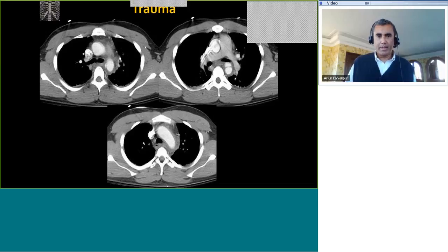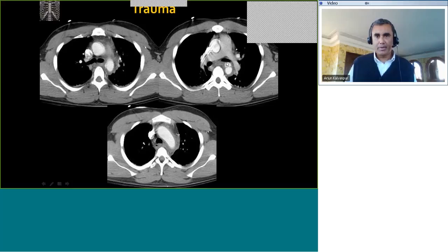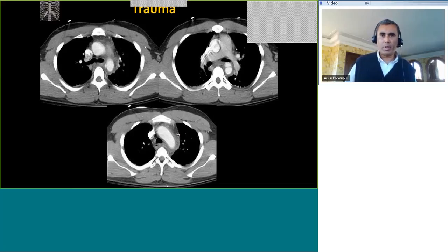In a patient with high-velocity chest trauma, the first thing you want to exclude is aortic injury, and the most common location is the aortic isthmus — that is where your eye should go first. And behold, there is in fact a small saccular traumatic pseudoaneurysm of the aorta at the aortic isthmus, and it is in fact leaking, with mediastinal hematoma associated. Please always remember to look very carefully at the aortic isthmus, just below the carina at the level of the pulmonary artery bifurcation.